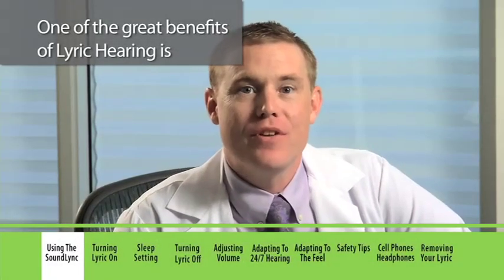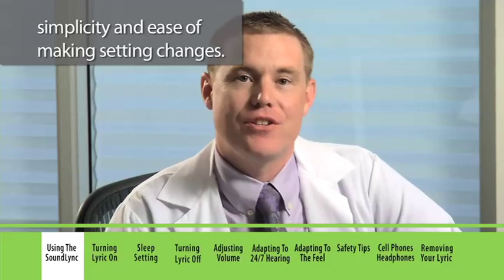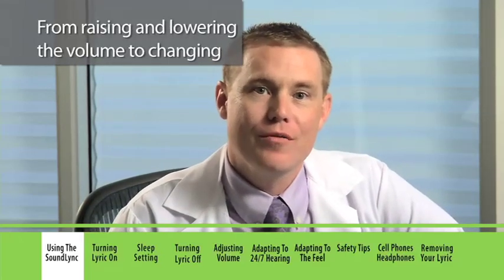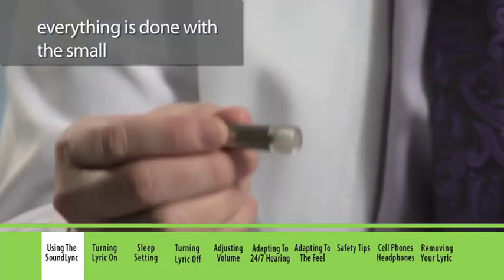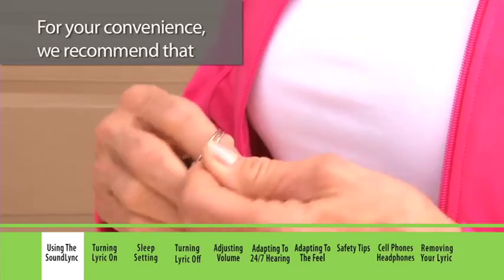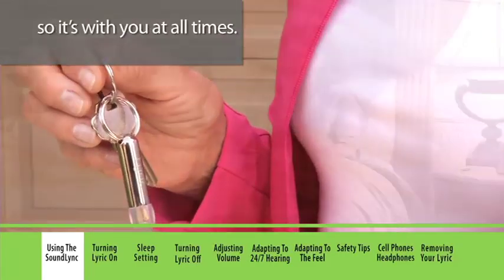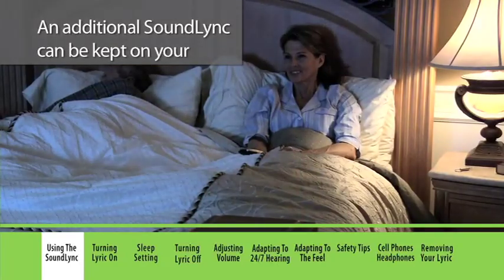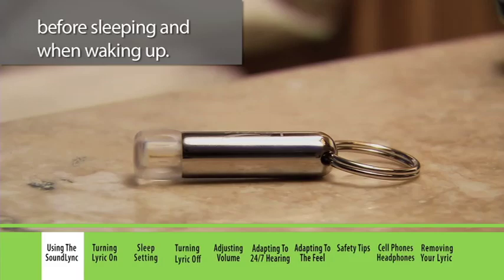One of the great benefits of Lyric hearing is the simplicity and ease of making setting changes, from raising and lowering the volume to changing it from on into sleep setting. Everything is done with the small SoundLink adjustment tool. We recommend that you keep the SoundLink on your keychain so it's with you at all times. An additional SoundLink can be kept on your bedside table so you can adjust your Lyric before sleeping and when waking up.